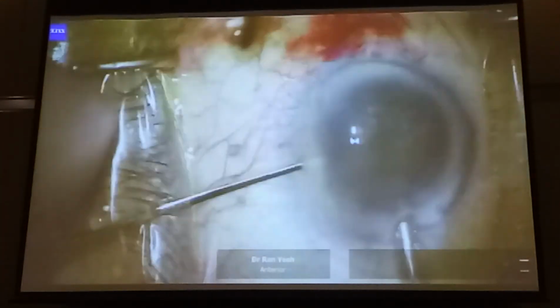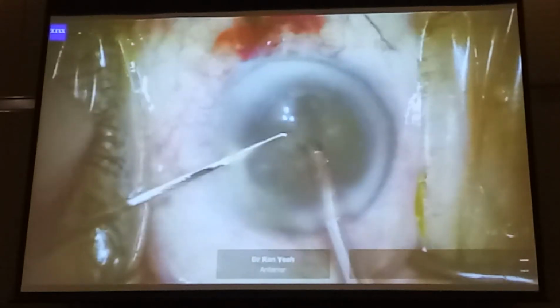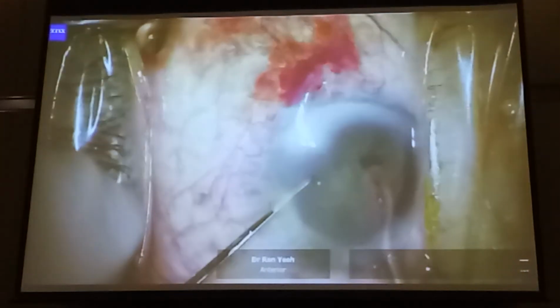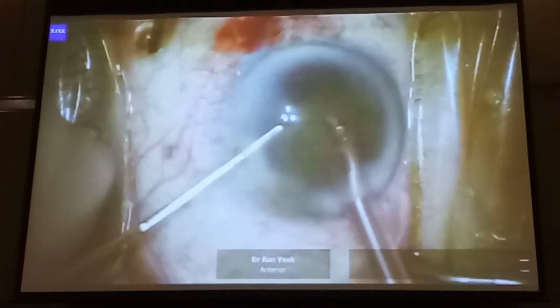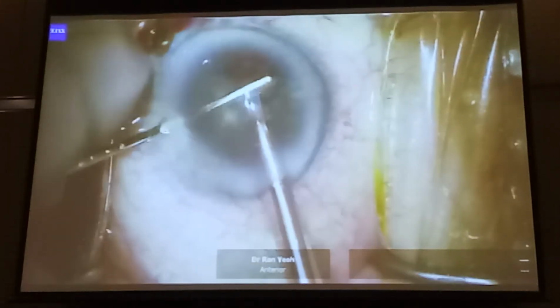So I come back out, and then just bring the phaco tip in, and because that's free and there was a bit of a crack there, then you go to memory 2 and you just grab the edge of the nuclear fragment and you can pull it out. There. And so once you've got one fragment out, then the rest is straightforward.